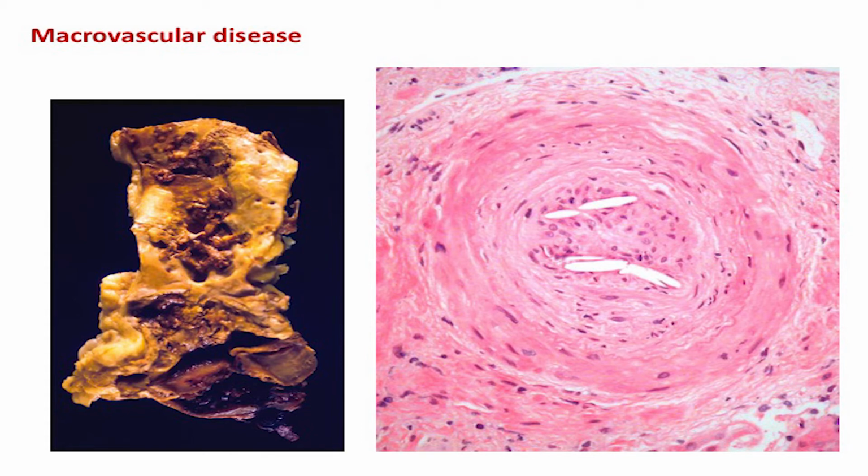Now I'm going to show you some pretty pictures of some of my cases, which get increasingly confusing as we go along. So I frequently see atheroemboli, demonstrated here nicely in my biopsies from diabetics. On the left is a diabetic patient that I got the big biopsy from in the post-mortem room after they dropped dead from their aortic aneurysm. And it just goes to show you the severity of aortic atherosclerosis in your patients. And lumps of this are breaking off and embolizing the kidneys all of the time.